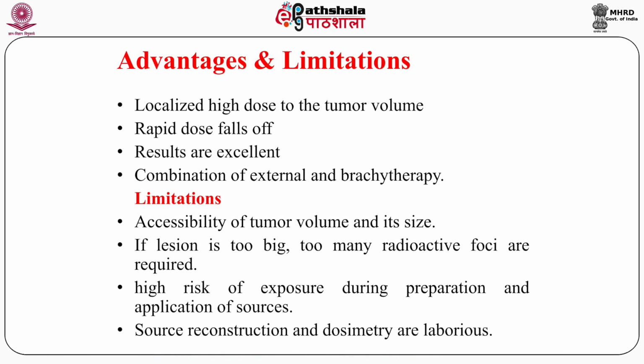The second limitation is that if the lesion is too big, too many radioactive foci are required. If the tumor is big, then we have to adjust the applicator in such a way that the source positions would be many, and the treatment time will be very high in that case.